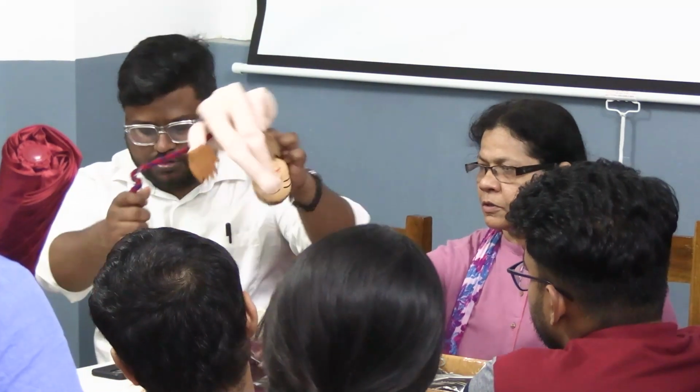At least 5 cm রাখা উচিত, ঠিক আছে, because যদি বাচ্চা কোনো রকম ভাবে ডিপ্রেসড হয়, হাইপক্সিক হয়, I need this cord for giving any kind of medications. আমি বাচ্চাকে ডাইরেক্ট মেডিকেশন দিই না, we give it into the umbilical cord always, medication or transfusion, both infusion or transfusion both. দুটো ক্ল্যাম্প লাগালাম, ঠিক আছে. I'm cutting in between the two clamps. This part goes to the pediatrician with the baby, and the other part is my part of significance, this one here.